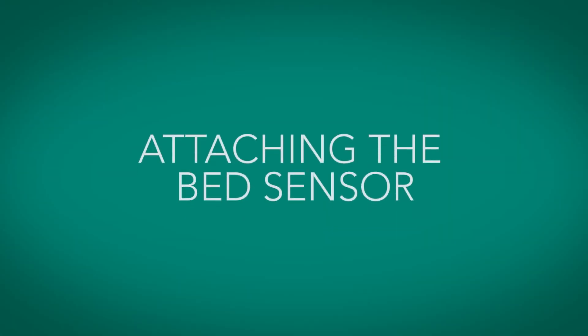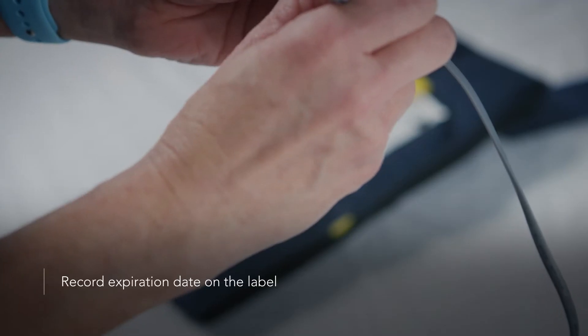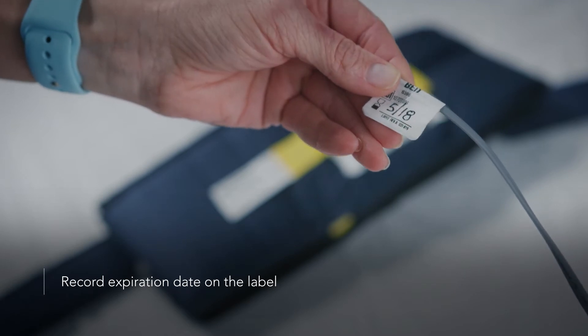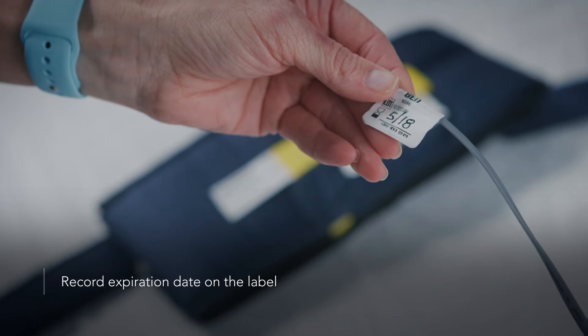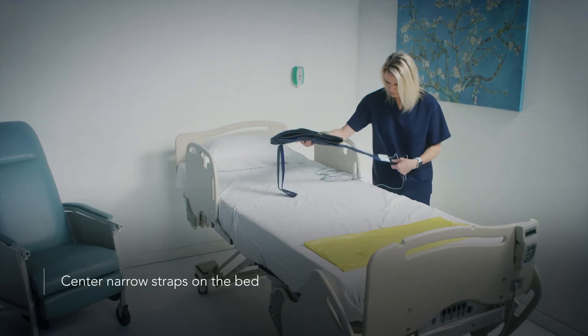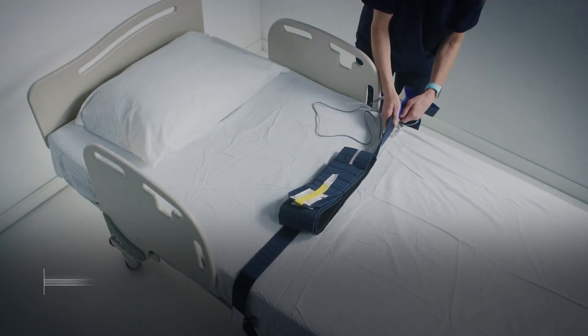Let's discuss how to attach the Head Start Sensor to the patient bed. First, remove the sensor from the packaging. Record the expiration date on the label attached to the sensor cord. The Head Start Bed Sensor is indicated for 30 days of use on a single patient. Center the narrow straps on the bed so they are crisscrossed with the yellow handle on the wide belt strap facing up.